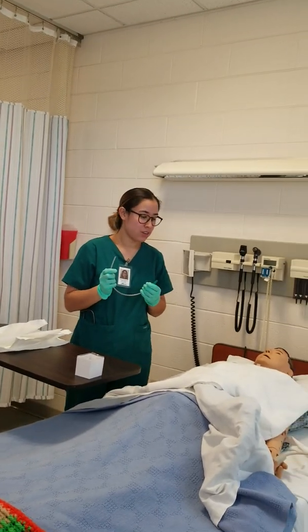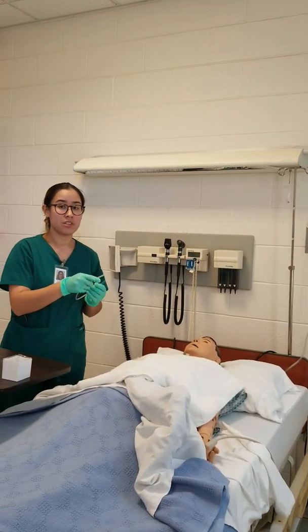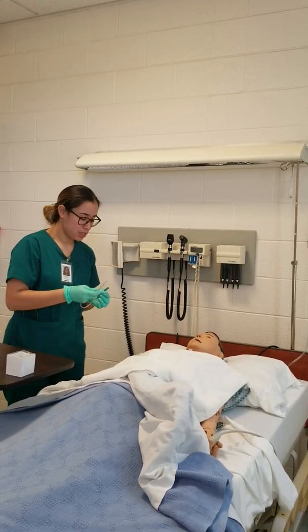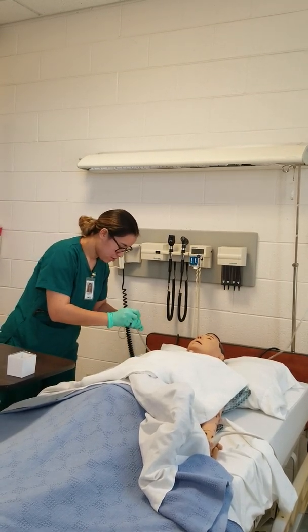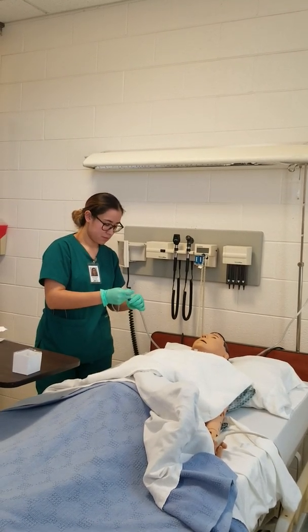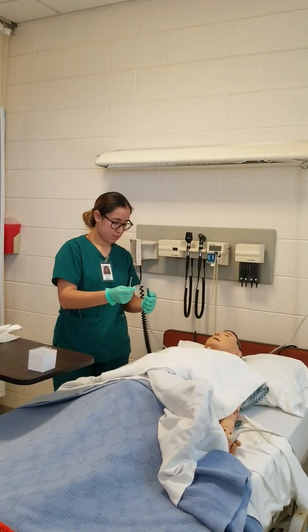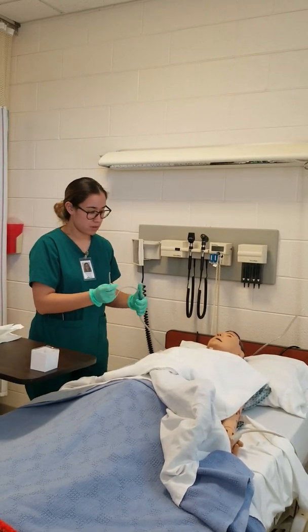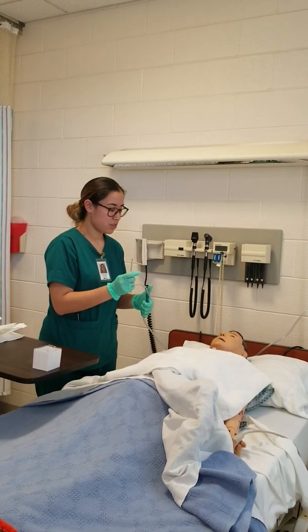Before I start the procedure, I'm going to go ahead and check the oxygen on the patient. If the oxygen is low, then I'm going to go ahead and oxygenate my patient. Once I oxygenate my patient, I'm going to go ahead and plug this together. His O2 is good, so I'll start suctioning.